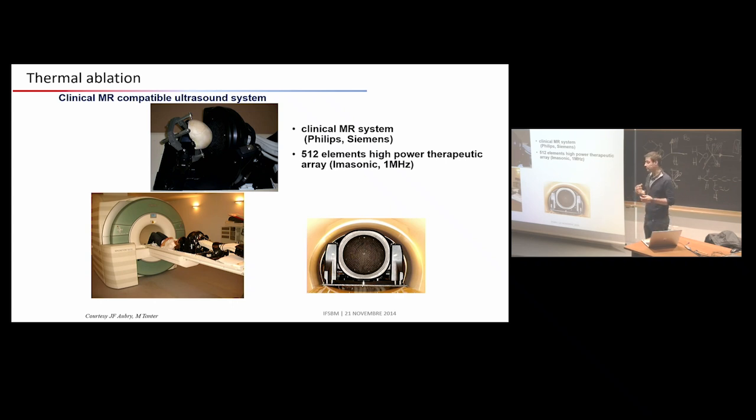they developed different devices, more complex devices, like those helmets at very low frequency. So I don't know if you're able to see the different spots inside the helmets. There are about 512 in that one. I will show you another one with more than 1,000 elements. So those are single elements. Typically, an ultrasound probe is 128 to 256 elements. You see here, we have many more elements than for ultrasound imaging. Why? Because we need this to allow very good focalization inside the brain. And this helmet allows us to really focalize in a very small spot inside the brain.